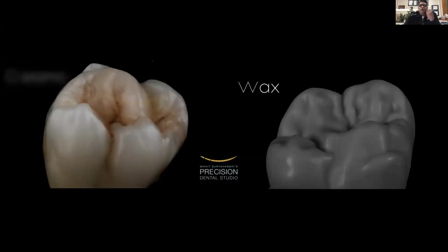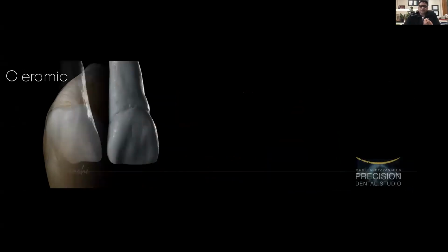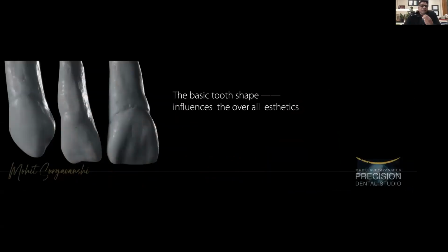What we try to mimic in the final ceramics, we should start exercising with wax first. Hence, exercises on wax play a very vital role in every dental laboratory. People have started thinking that digitalization means getting rid of the wax-up. But as long as you are strong in the analog way, only then will you be able to achieve success the digital way.